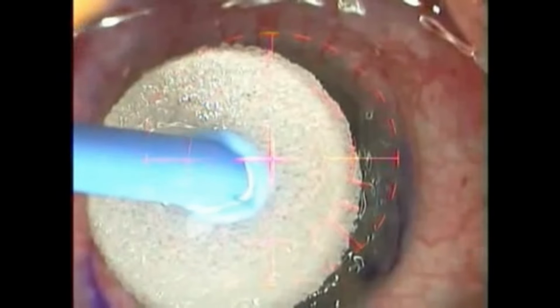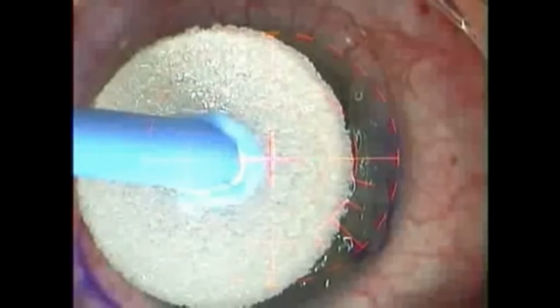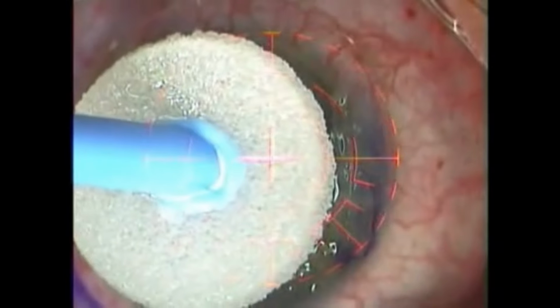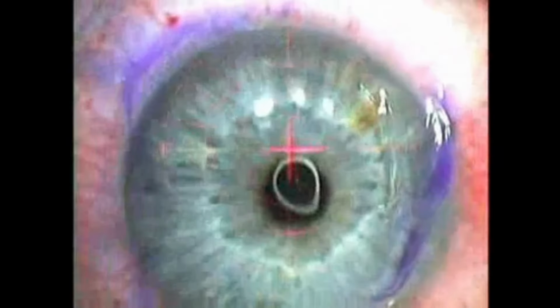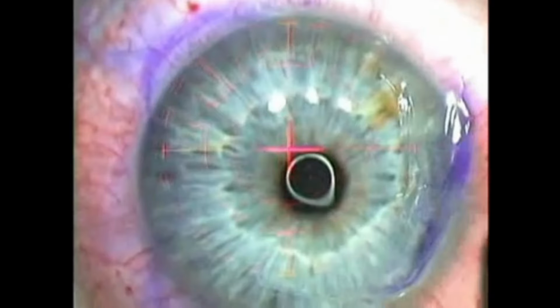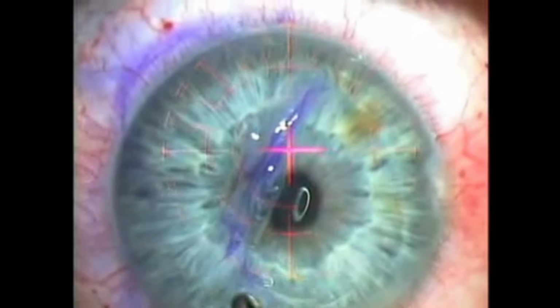This is preferred over chilled BSS, as chilled BSS irrigating copiously over the epithelial flap will cause additional devitalization of epithelial cells. A small amount of BSS is in place across the stromal surface to allow adequate lubrication for sliding the epithelial flap back in position. This is done once again with a blunt spatula, which should grasp the leading edge of the epithelium, gently repositioning the epithelium back into its original place.